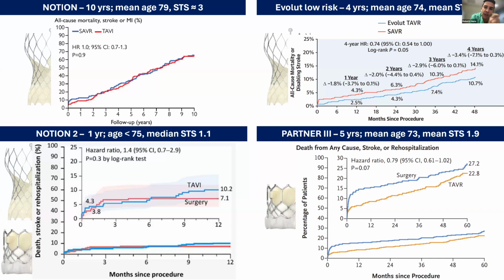And I think your strategy is reasonable, because you're planning to put a second SAPIEN valve into the first one. We know that this is not a small one, so we have no issues about the durability and the gradients, the dysfunction that came up in the recent data about balloon expandable platforms. So I think this is a very nice consideration, but always consider that there is still the opportunity to perform surgery.